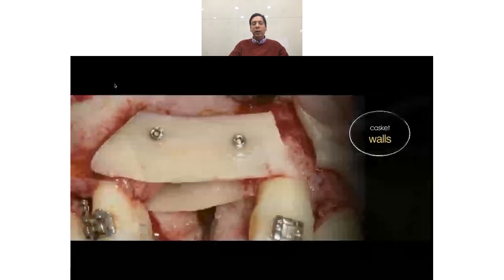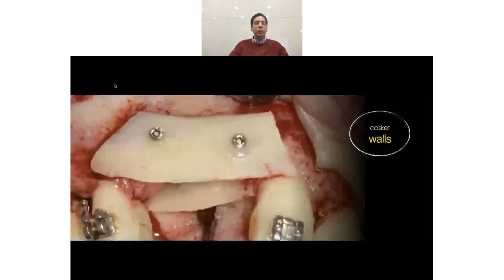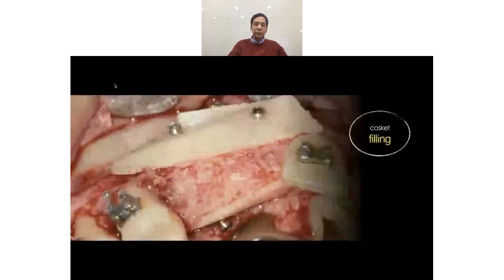I will not speak about that because Dr. Kuchu will speak a lot about that. And then when we split the blocks, I place a block in the buccal aspect and I place another block in the palatal aspect. Then after I put both walls, I fill the gap with particulated bone, autogenous bone, everything.